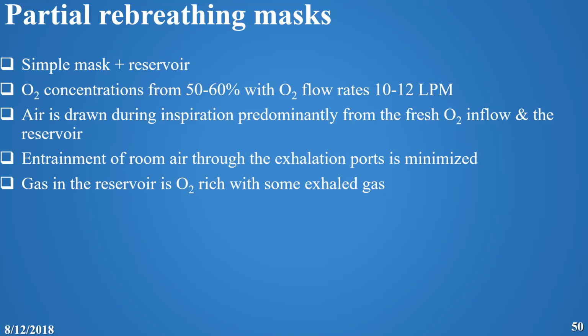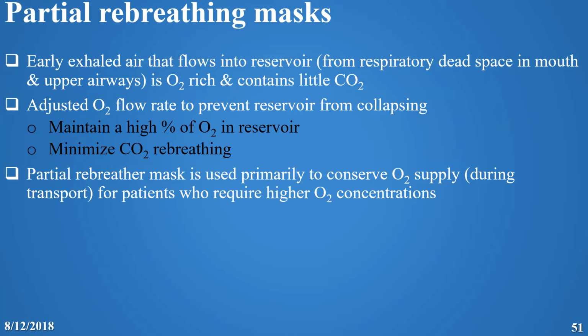The reservoir is mostly rich with oxygen, but sometimes there is some exhaled gas. The early exhaled air flows into the reservoir from the respiratory dead space, which is the nose, the mouth, the nasopharynx, the upper airway.